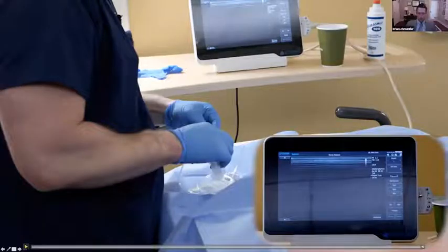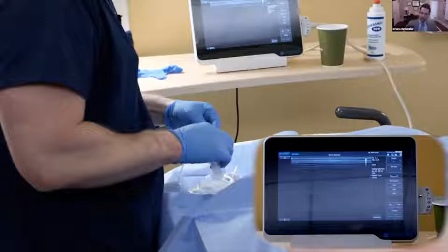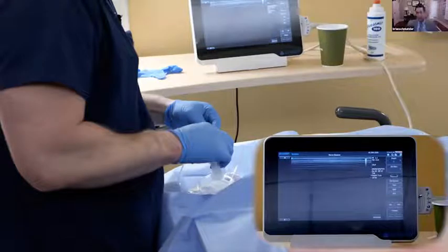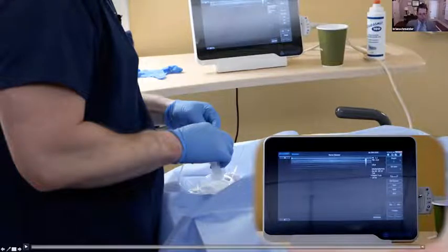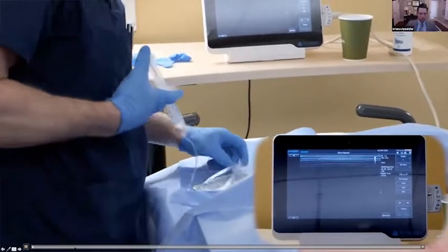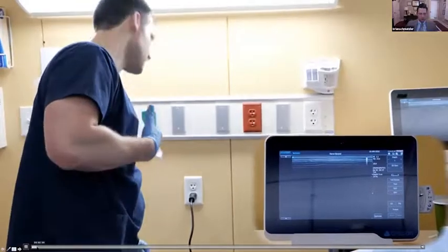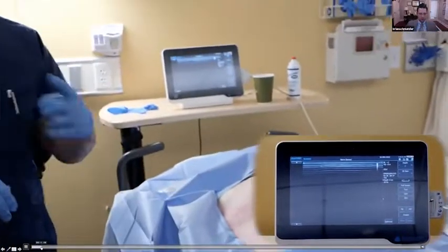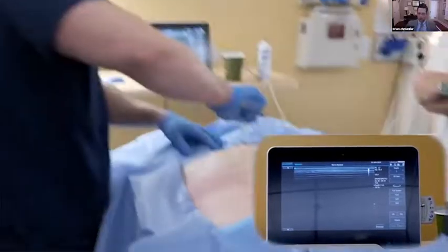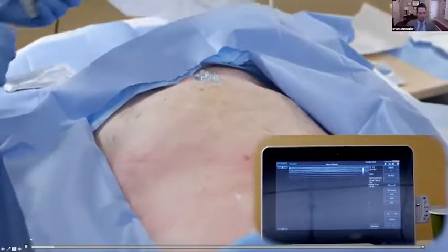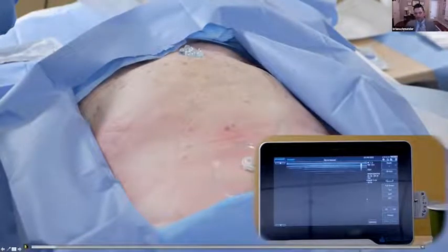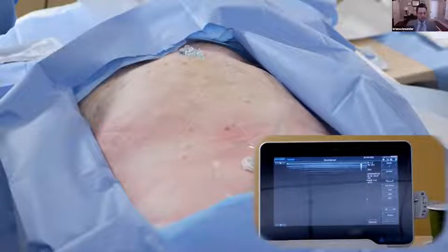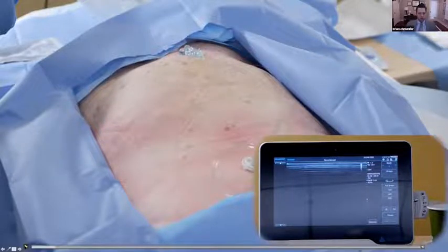Now let's go forward to the cadaver demonstration, where I'll show you how I use the needle, see it hitting the transverse process, backing off, injecting the fluid, and threading the catheter in. The catheter over needle has been great for that. We're in the thoracic region, probably high to mid-thoracic.